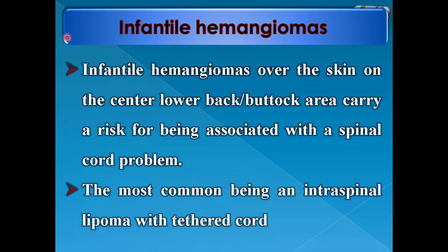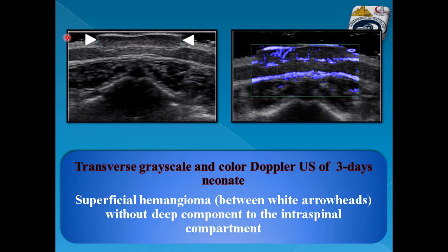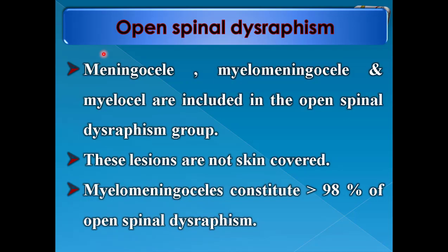Infantile hemangioma over the skin on the center lower back and buttock area carries a risk for being associated with a spinal cord problem, the most common being an intraspinal lipoma with tethered cord. This is an example of transverse grayscale and color Doppler ultrasound of a three-day-old neonate. The superficial hemangioma in the skin is shown by B-mode ultrasound, and by color Doppler there is increased vascularity but without intraspinal extension — confirming it is a superficial hemangioma of the skin.